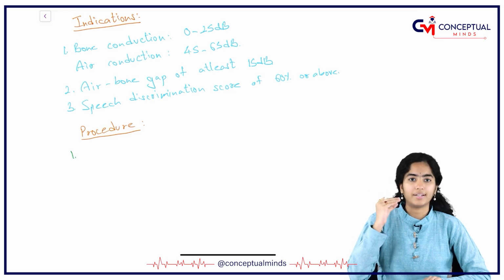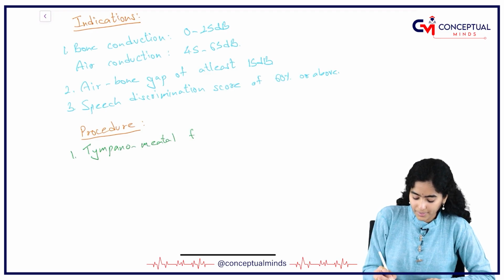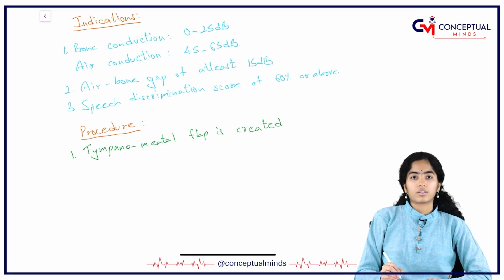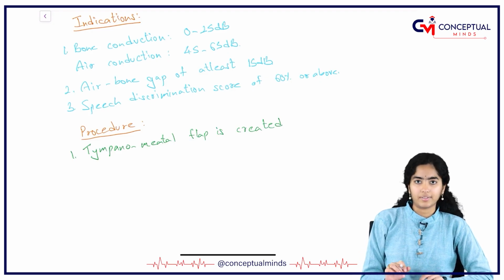A tympanomeatal incision is given and a flap is created. And this will show us the way into the middle ear.